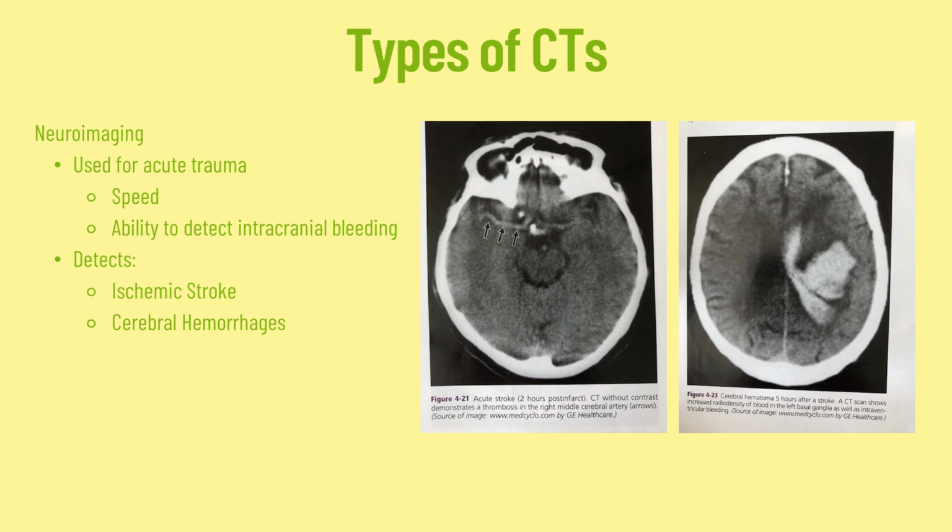When that blood vessel gets blocked, now that blood is not going to the other parts of the brain, causing cell death. Now these show as small round lesions, and it could be anywhere in the brain stem, in the basal ganglia, in the thalamus. That's commonly where they occur. And then in the large vessels, the thrombosis can show up and appear more radiodense, so they're going to be brighter on that CT scan than the surrounding brain tissue, which is what you're seeing on the image on the left. And then cerebral lesions are going to be dark because of the edema.